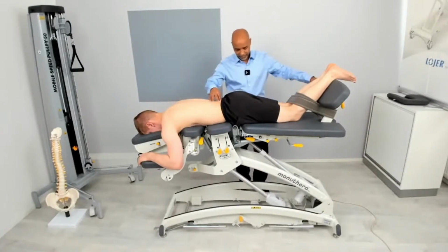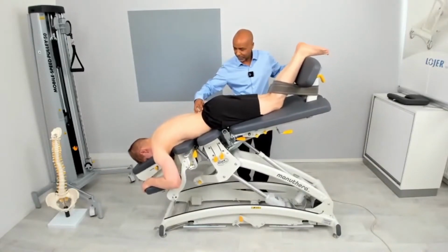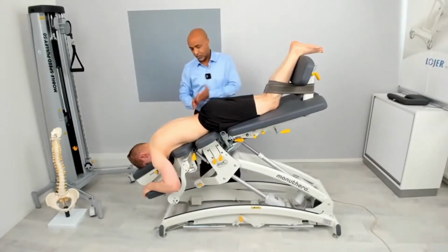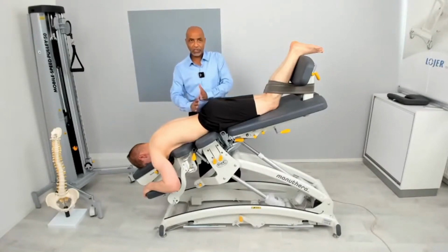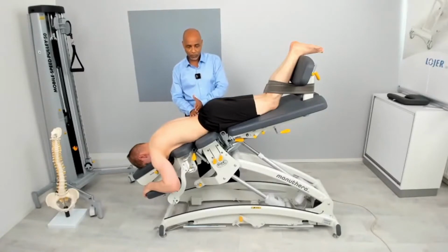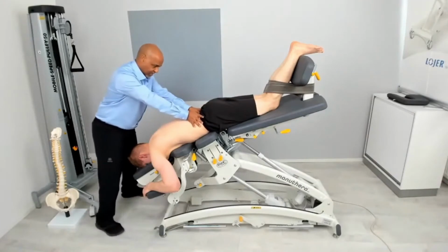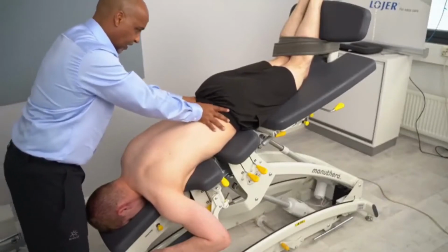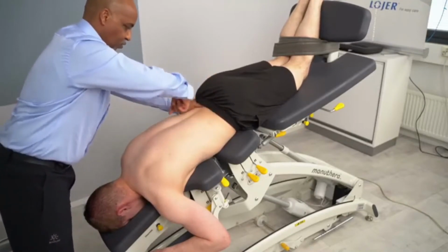So by doing that, I'm going to activate the tilting position. Gravity will assist me. Now this particular patient is under traction. Once we create the traction, we know the disc has less pressure because of the angle and because of the position we're using. So in that case, I can try to locate and palpate this way to identify the sore spot. Once I locate it, let's say it's L4 and 5, maybe L5 and S1, we know the gravity is working towards the head.